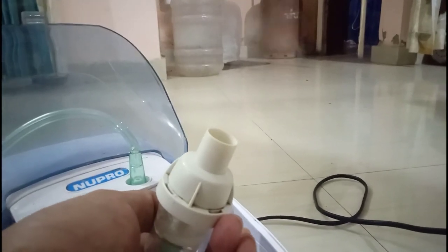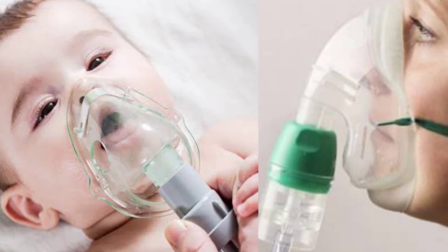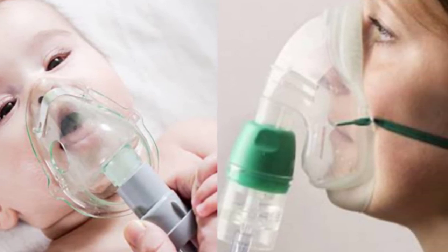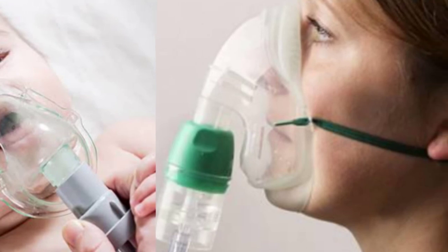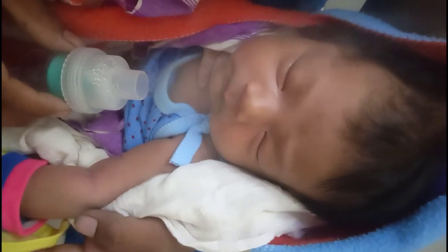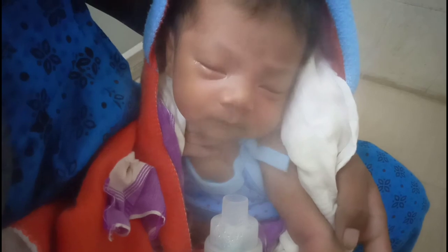Now it can be given with a mask or without a mask, as shown in the picture. In this baby, I have not used a mask because he feels disturbed and cries when I use a mask.